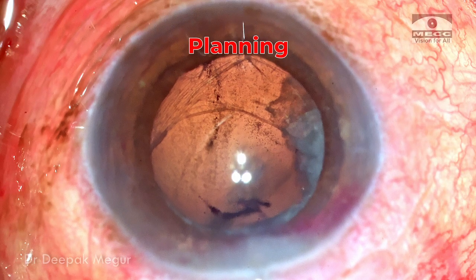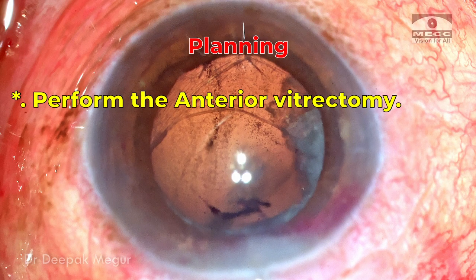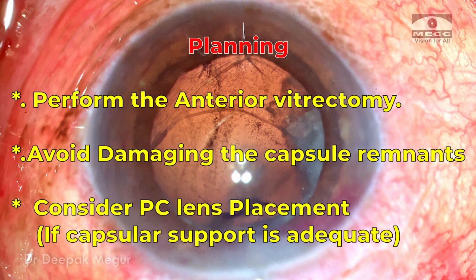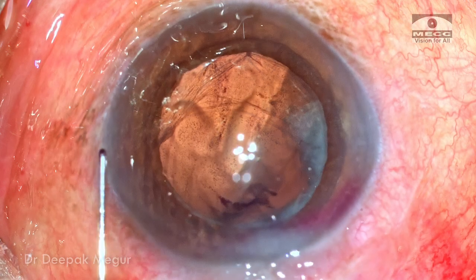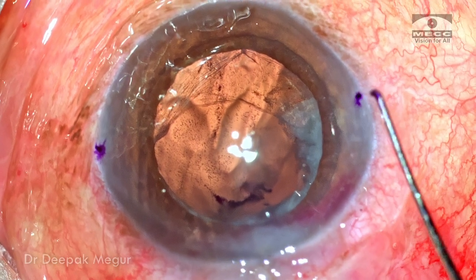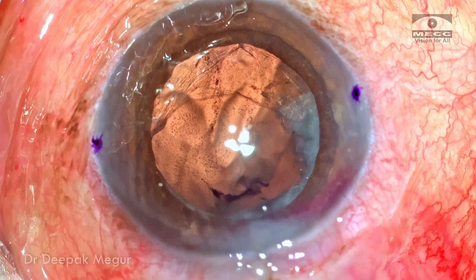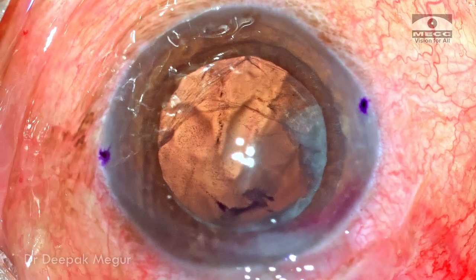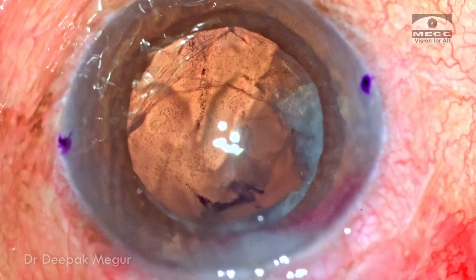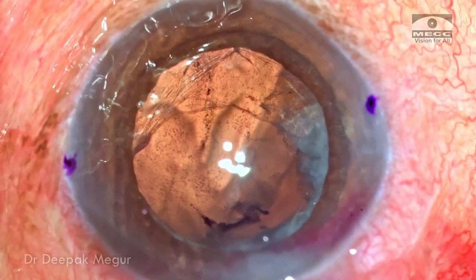At this stage, my plan is to perform an anterior vitrectomy taking care not to damage the capsule remnants, because if there is adequate support I may still consider placing a posterior chamber lens. Before I begin, I'm going to mark the two ends where I'll create side ports, as these are what I will use if I need to enclave the iris clip lens — giving me a proper guide to place the hooks of the iris claw lens.